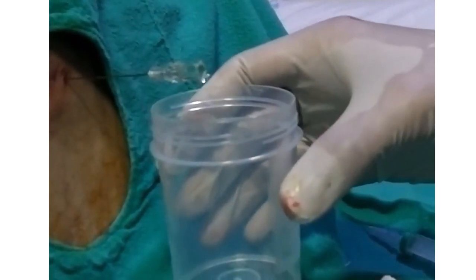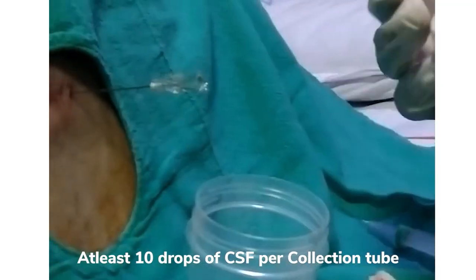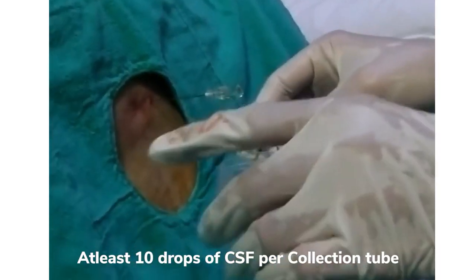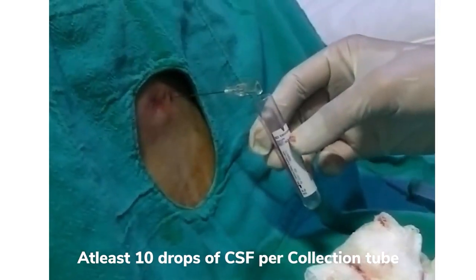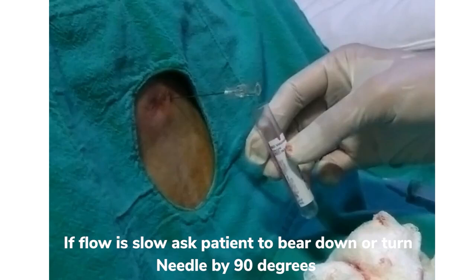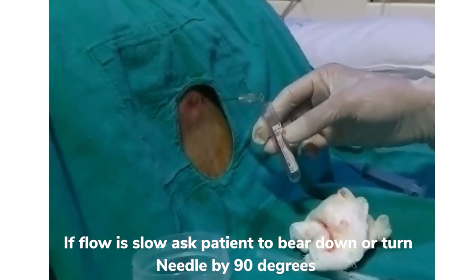Now, how much CSF should you collect every time? It should be approximately 10 drops of CSF in each of the plastic bottles. If the flow is slow, ask the patient to bear down as in Valsalva maneuver. Alternatively, you can rotate the needle by approximately 90 degrees and you will get a good flow of CSF.